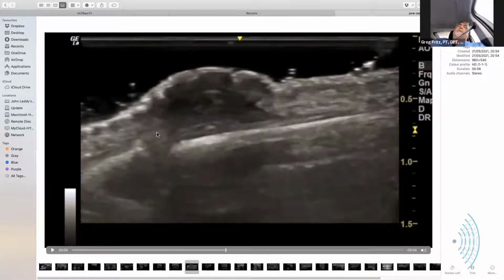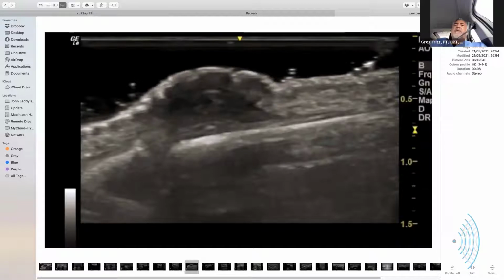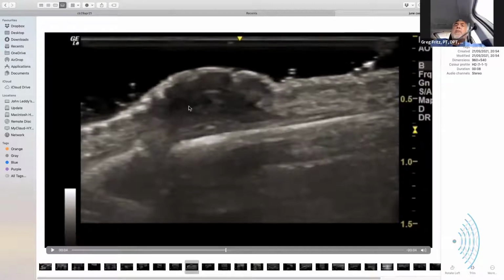And you can just about make out the flexor, the extensor mechanism. And then you get this little squish just under the skin. And the patient complains of a little lump sitting on the top of their finger. And when you scan them, you don't really see anything until you look really carefully. And then there's just a tiny bit of thickened tissue here. And it's called a Garrod's pad.